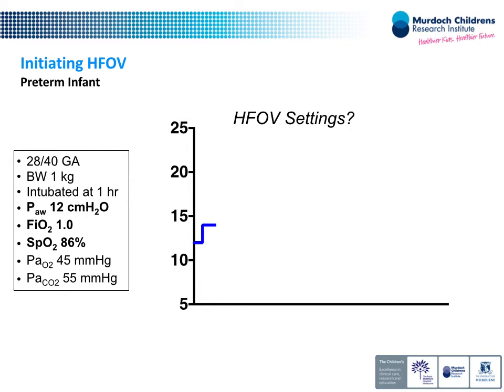I find if you put the kid on the Sensormedics, it's going to... And so that would dictate where I might choose. But then you're going to look at the FiO2. If the FiO2 can come down nicely, then you might be okay with your MAP. But if it's taking a while, you might need to go higher. So 2 might be a place to start with.